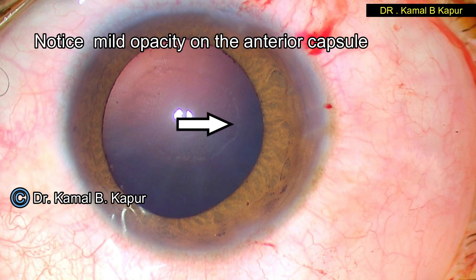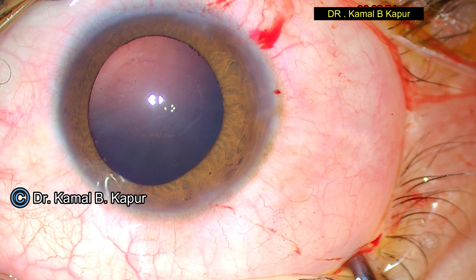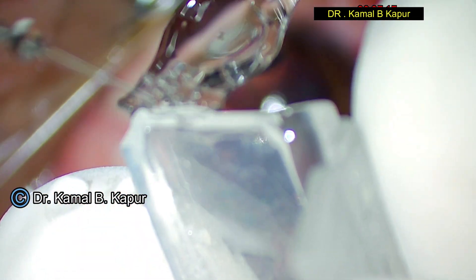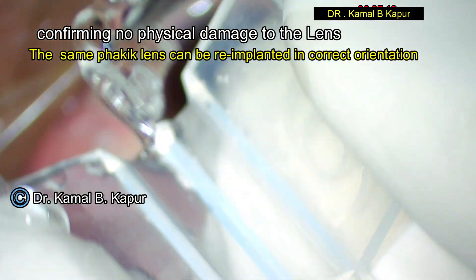We want to preserve the lens because we will be re-implanting it in the patient's eye again. If a sharp instrument is used, we may end up damaging the phakic lens or IPCL and would not be able to re-implant the same lens. As you can notice, there is an anterior capsular opacity circular in the center. After confirming there are no marks or scratches on the phakic lens, it is fit to be re-implanted.